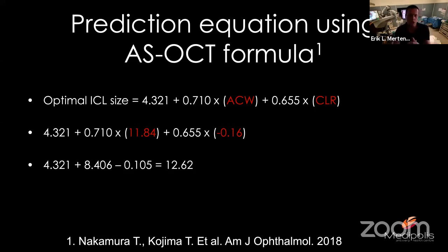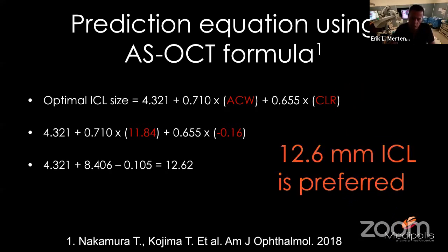Currently, we're working on optimizing this formula for the MS39, because this formula was not calculated for this anterior segment OCT, but we hope to come soon with a new formula specifically dedicated to the MS39. So this is what we implanted.